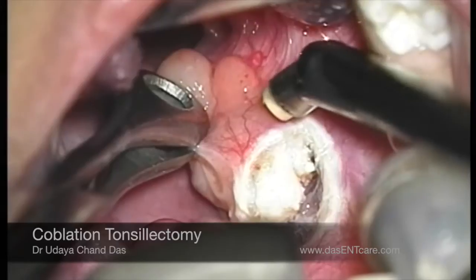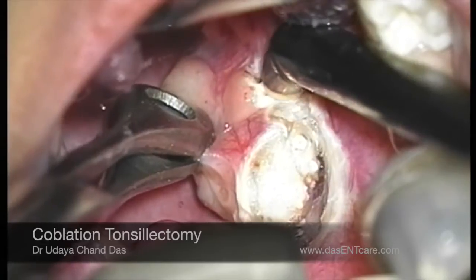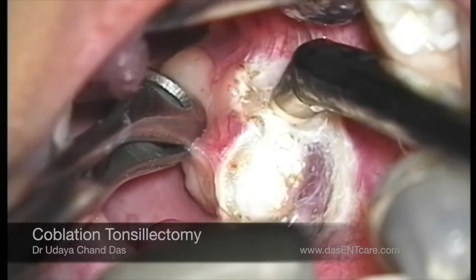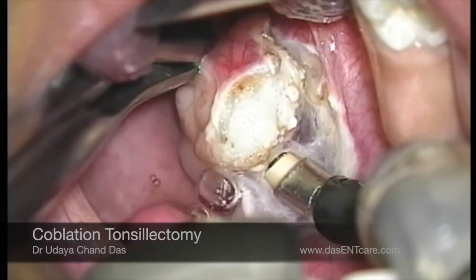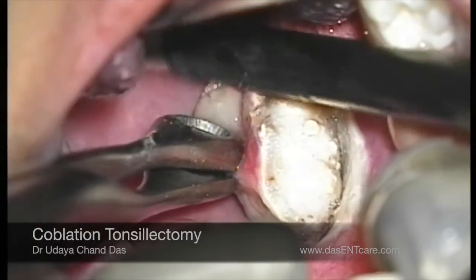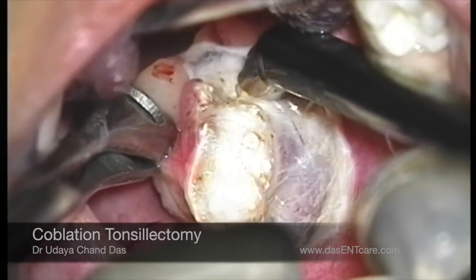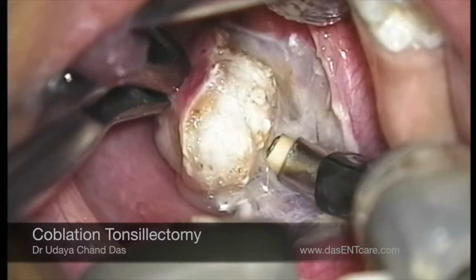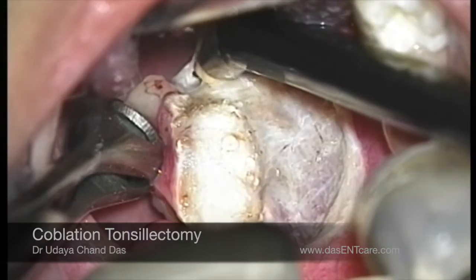If you notice, the tip of the instrument is not touching the tissues being dissected — it is the side of the instrument. Basically, the saline passes through the tip and at the same time the radio frequency current also passes through the tip from a different port. This radio frequency energy cleaves the bond of sodium chloride, which is the saline, and produces sodium and chloride ions. This sodium ion forms a plasma energy field, and this plasma does the tissue dissection, thereby sealing the blood vessels even before they are cut.